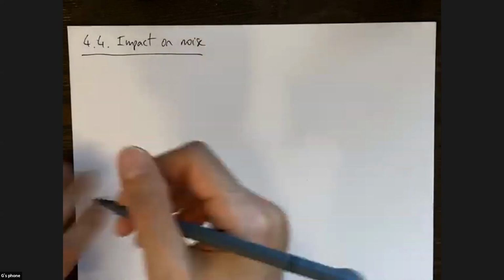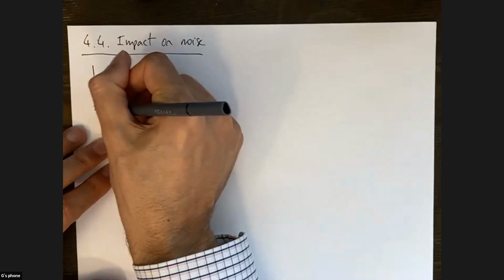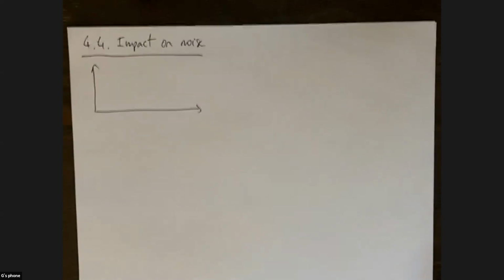So this is a high level view of noise. An image that contains noise has a frequency spectrum as well. If you were to acquire a picture with a camera of something that's a uniform color, a white sheet of paper for example, the sheet of paper is perfectly white, but if you look at the image there's a little bit of noise. The pixel value will not be exactly the same across the whole image. So that's due to noise.